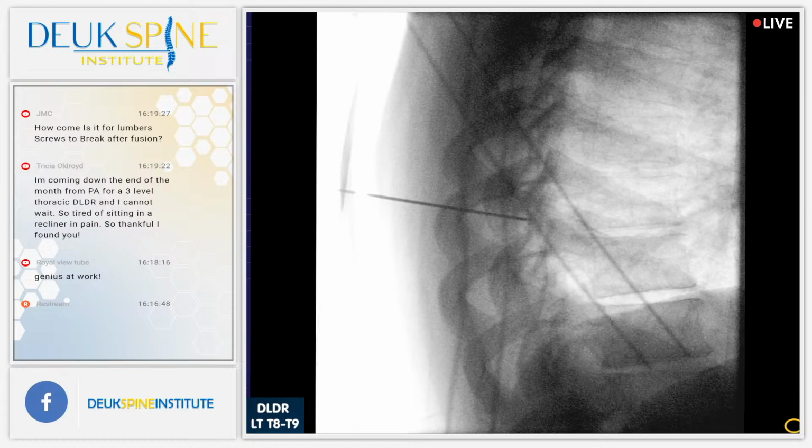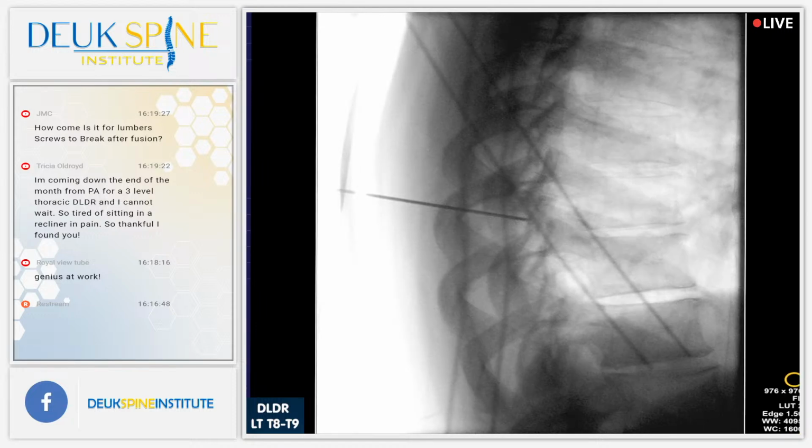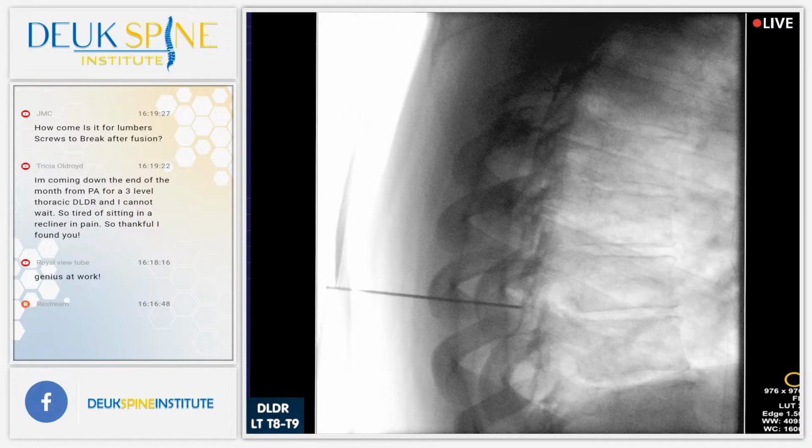Shot. All right. Any way you can get that lined up better? I think we're off on wag. Somehow he's moved a lot. I think that's better, right, Luis? Shot.